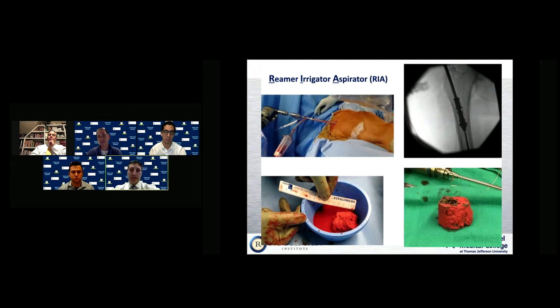I have more recently gone retrograde in the femur. The biggest thing is, you pick your poison, whether you want some post-operative hip pain or post-operative knee pain, but I have gone more to the femur. I personally would stay away from the tibia in particular because I wouldn't want to weaken those cortices. The tibia is right there. It's convenient. I'm not saying I've done it, I'm just asking. Yeah, it's obviously convenient, but the most convenient is not necessarily the best option. If you weaken those cortices, for instance, if you ream too proximal and the nail stops a little short of that, you get a little bit of a stress riser. Now you're dealing with a periprosthetic fracture. So I tend to stay away from the tibia for that reason.